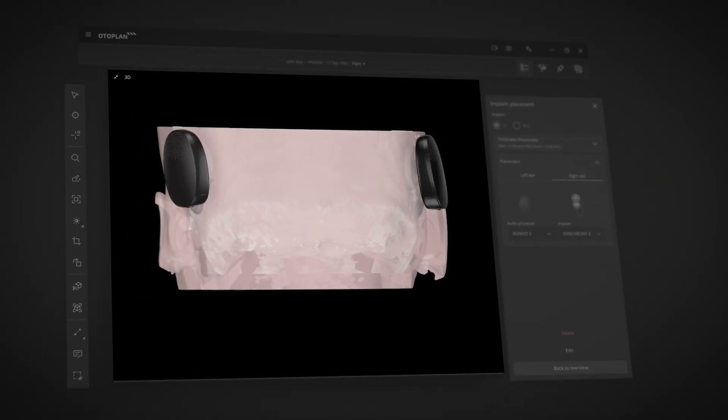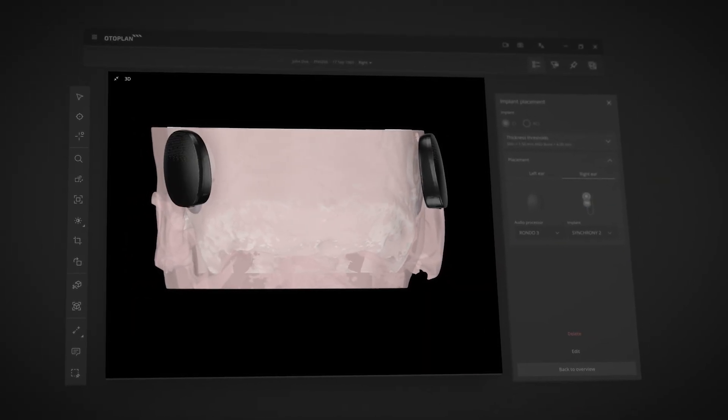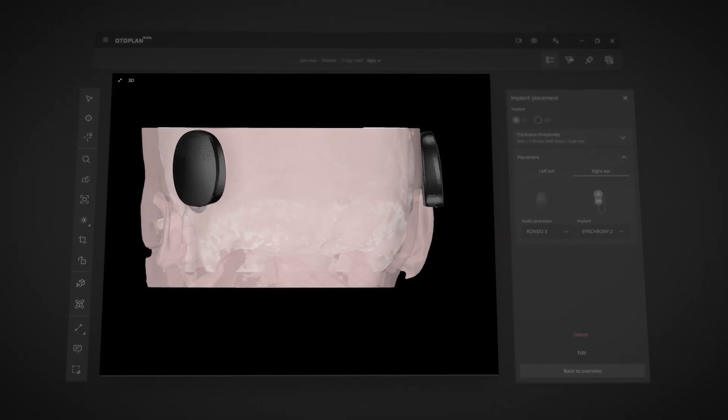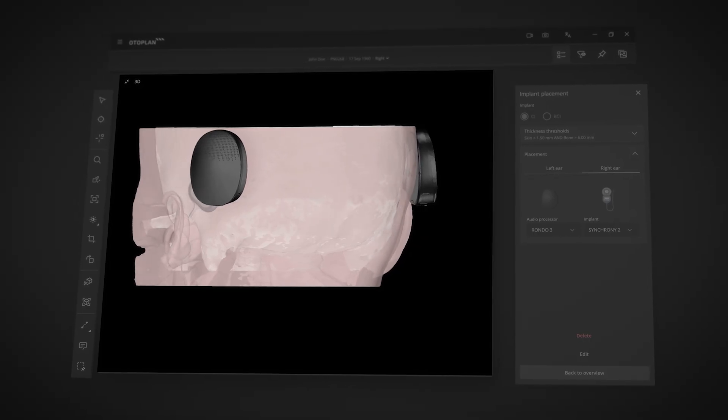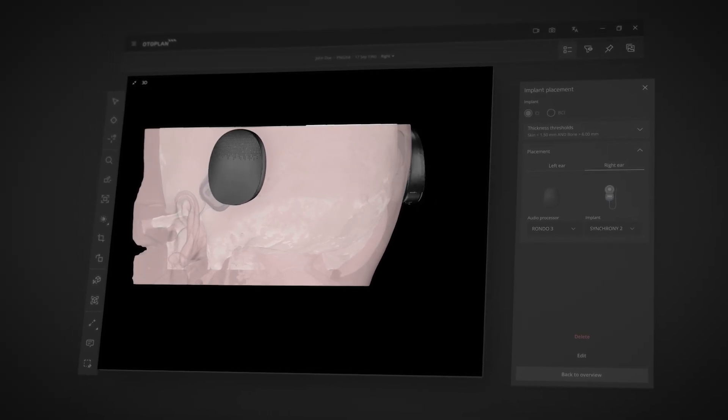For bilateral patients, OtoPlan allows you to mirror implant and audio processor positions to provide optimal cosmetic outcomes.